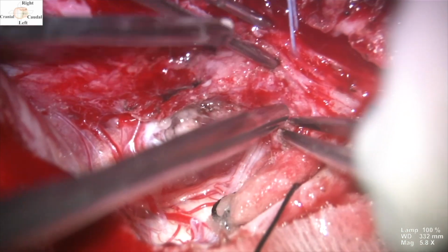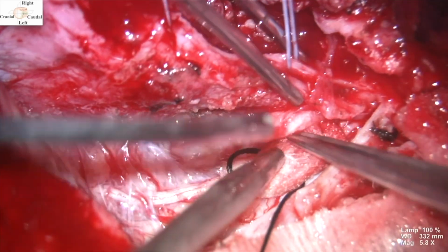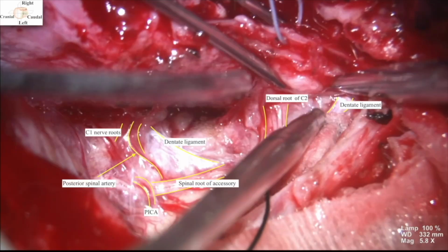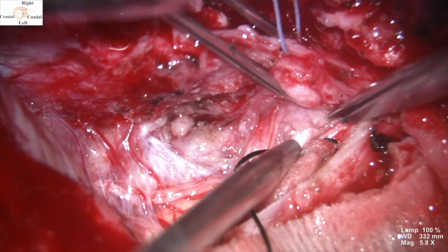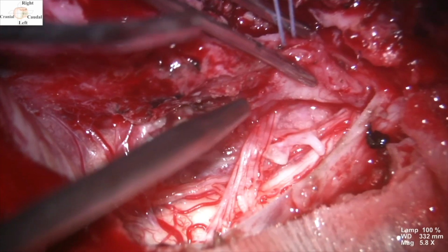After initial coagulation of the tumor and minimal debulking, we were able to get a window above and below the C2 dorsal nerve root. At this stage, the PICA, the posterior spinal artery, spinal root of accessory, and the dorsal nerve root of C1, along with the dentate ligament, were visualized. The dentate ligament was sharply divided to facilitate the mobilization of spinal cord and enhance access to the ventrolateral tumor.